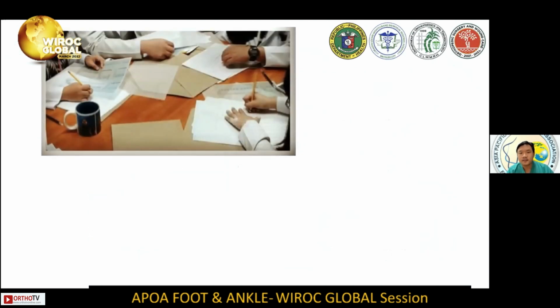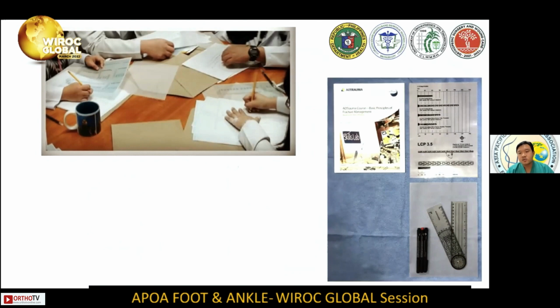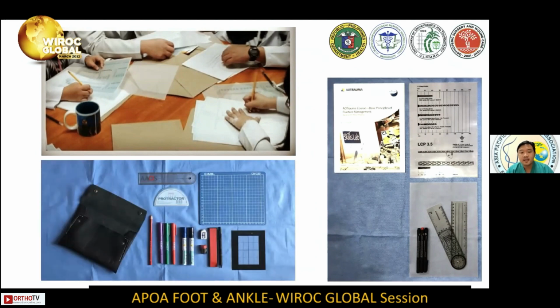So this is how a typical day in my conference room looks like with my residents doing their preoperative plans for their patients. This is what the basic kit features in the templating envelope. And this is what my templating kit looks like. I still use my templating kit from residency up to present.